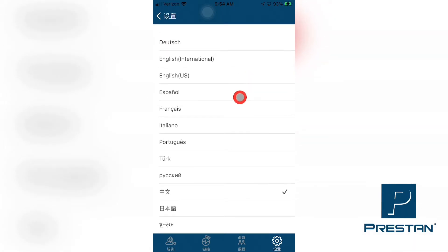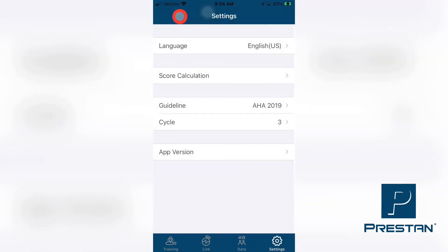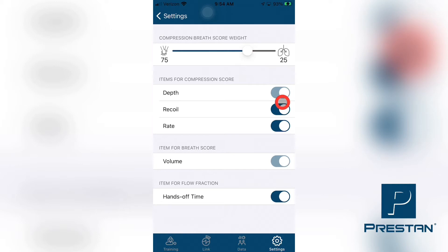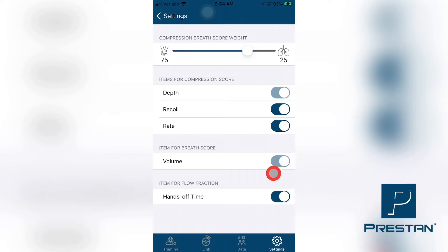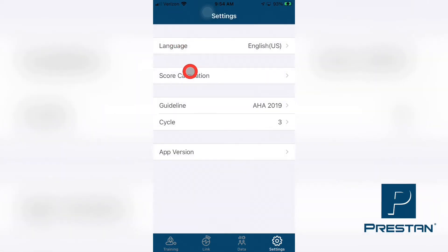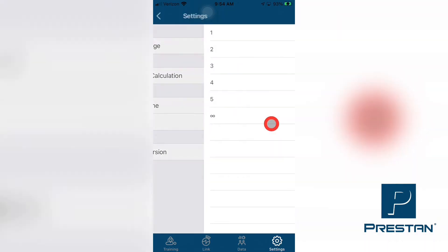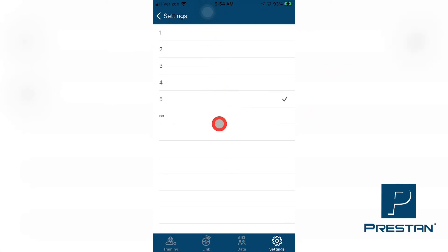These settings include changing the language and the measurement units used for the specific region in which the training is being performed, managing how the overall scores are to be calculated, changing the CPR guidelines between the available options. Lastly, the instructor can choose how many cycles of CPR are to be completed during a simulated cardiac rescue scenario before the app automatically ends the training and saves the data.